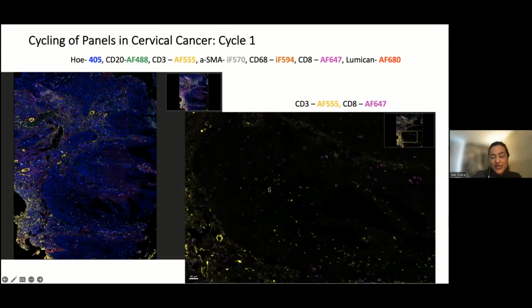So obviously, this yellow here is a staining for a T cell that is an inflammatory infiltrate in this region of the tumor, but these ones that you see here are the staining for the SMA, which is in a completely different location and staining a different marker. So this helps maximize the use of your confocal capabilities. It's sort of like the same line, but in completely different structures that you can differentiate by knowing what they're marking for.